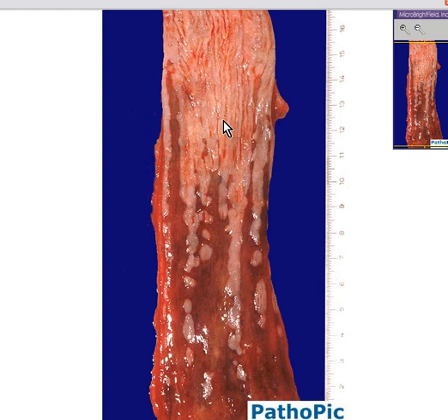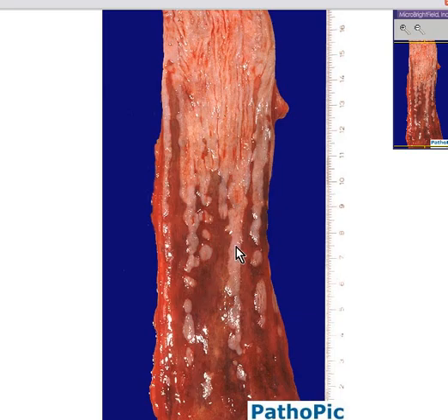That's exactly the concept of Barrett esophagus. It is an adaptive mechanism — a gastric epithelial metaplasia of a normal squamous surface.